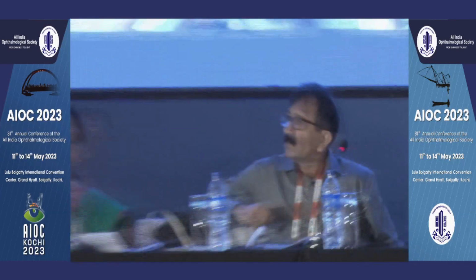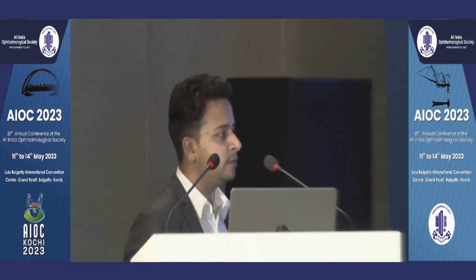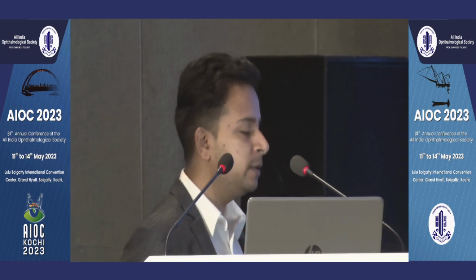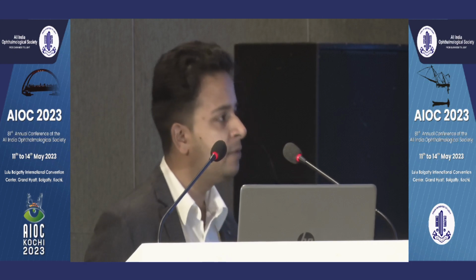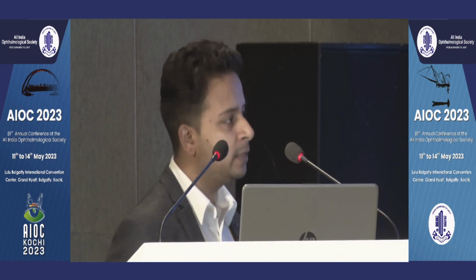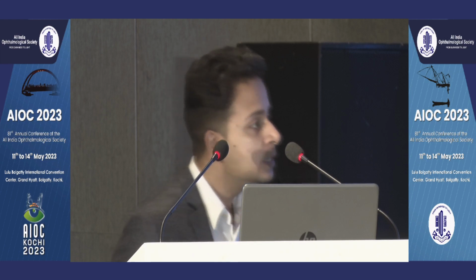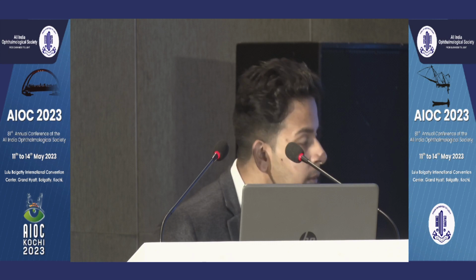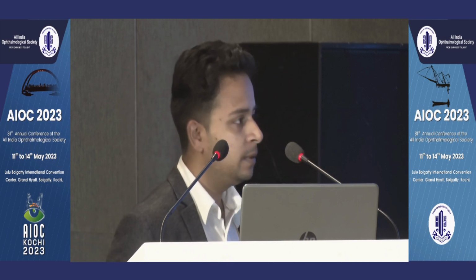When we're looking for progression, these things matter a lot. Sometimes we are manually checking the fields for progression, then these reliability indices have to be very well seen. We cannot miss this. You're absolutely right. What I mean to say is the reliability indices are already there in the printout, for every printout. You can know whether you have to rely on this field or not.